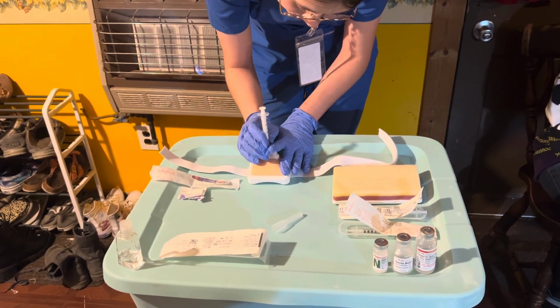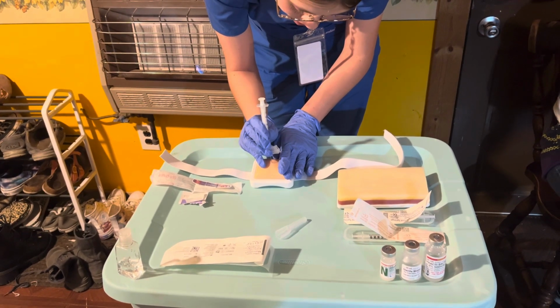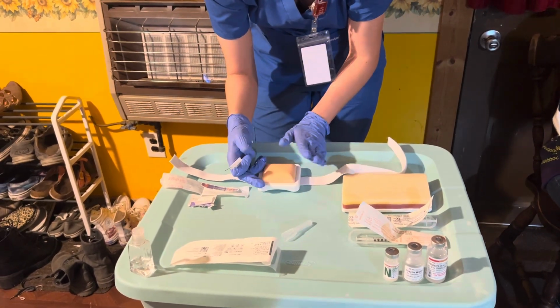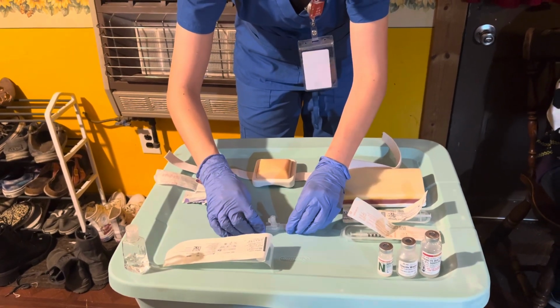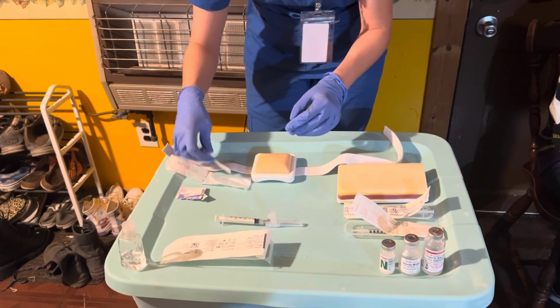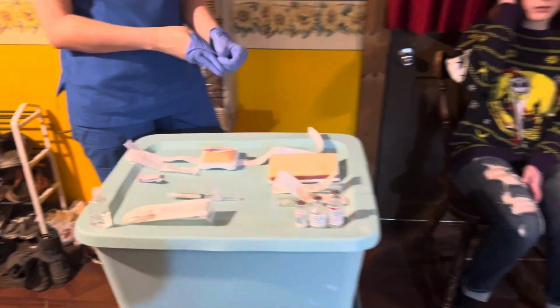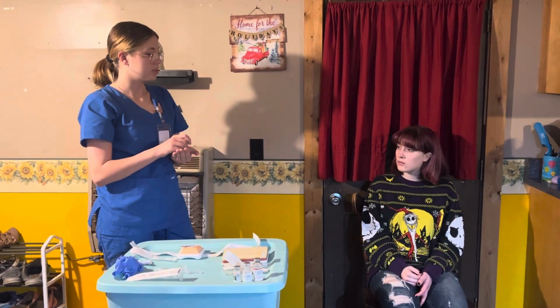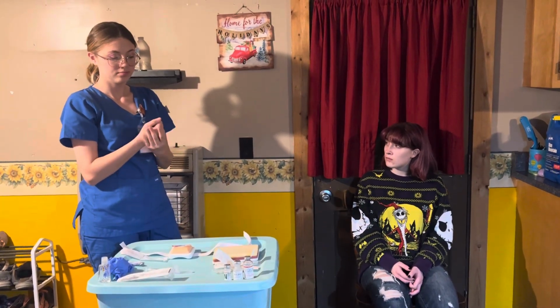Leave the needle inserted for 10 seconds. Withdraw at the same angle. Engage your safety. Well, first you'd let go of the skin. Engage your safety, dispose of it in the proper sharp container. For educational purposes, I will be recapping. And then you're going to put on a Band-Aid. And I'm going to dispose of my gloves, perform hand hygiene, come back after the appropriate amount of time and reevaluate in response to the medications. Immediately document.